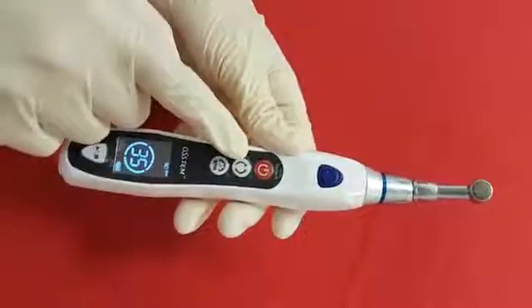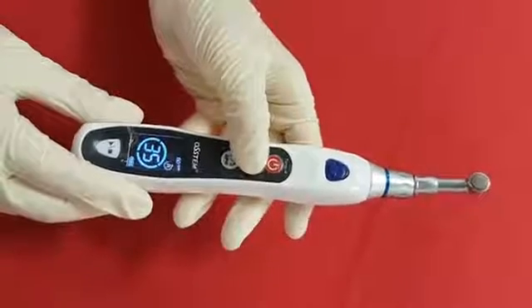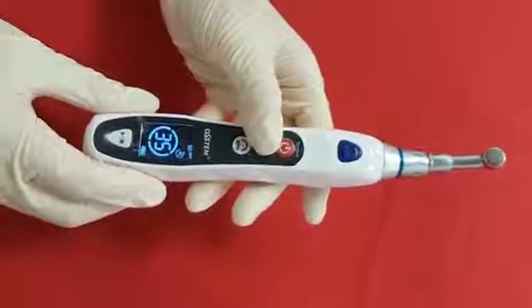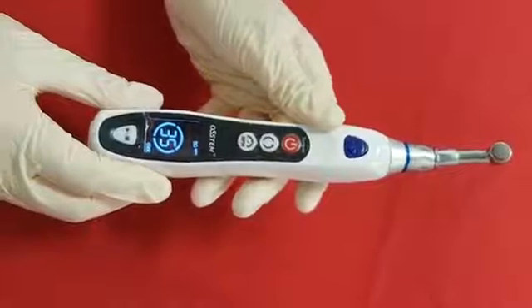Now the direction button. This is set in clockwise, and you can change it into counterclockwise with this button. The reverse mark will be on the LCD. Now we are going back to the clockwise again for the demonstration.